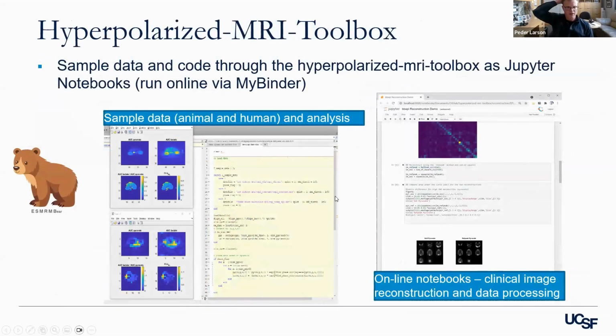A couple of the features that I think have really helped here as well are distributed sample data, which is just in line with the toolbox because it's much smaller than our lung data sets. We have sample code and Jupyter notebooks running Octave to process the sample data, so you have some benchmark people can run, something simple people can come in and do very quickly.